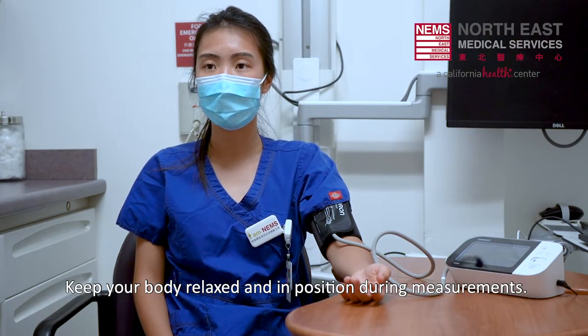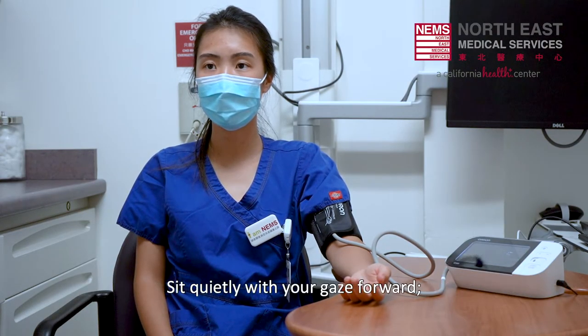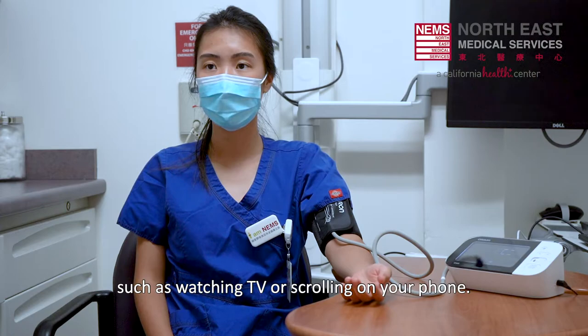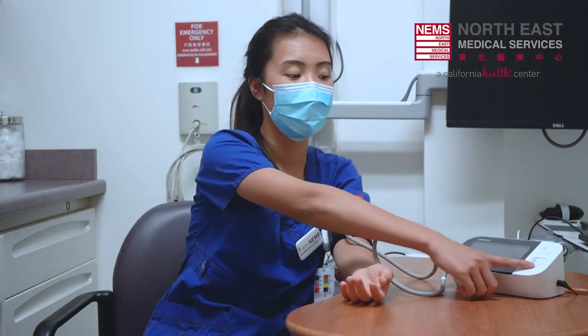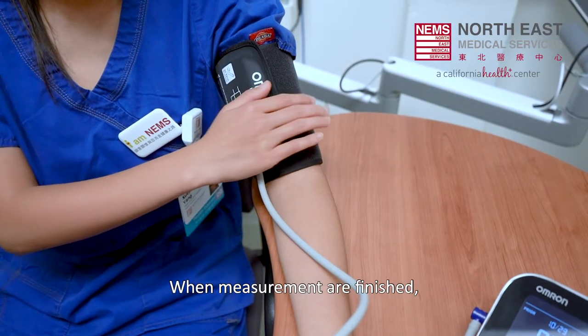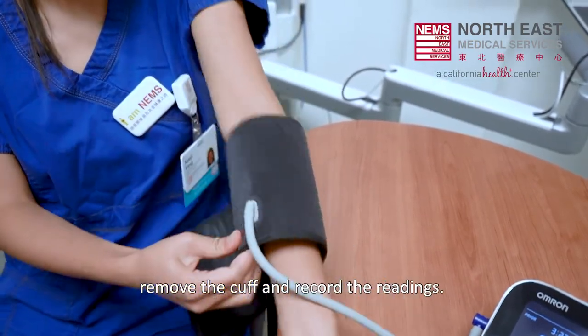Keep your body relaxed and in position during measurements. Sit quietly with your gaze forward. Avoid conversations and distractions such as watching TV or scrolling on your phone. Take 2-3 measurements with 1 minute apart. When measurements are finished, remove the cuff and record the readings.